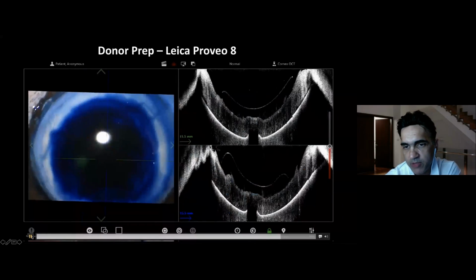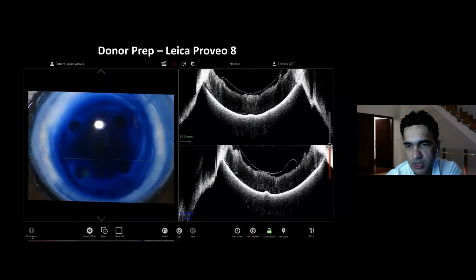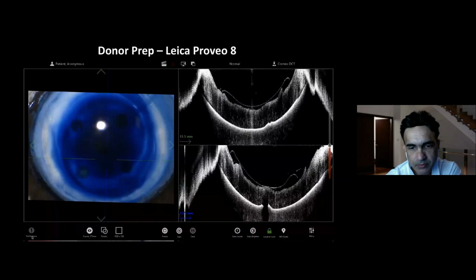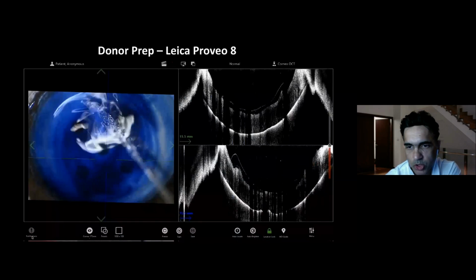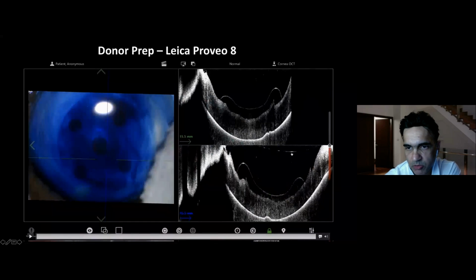Okay, typically we will leave this for incubation for about a minute, and then I'll wash off the fluid from the surface. Okay, so here we go. We're washing off the fluid. So you can see there's a rise in the amount of fluid over here. So now this is the minuscule rise of level of the fluid over here on the top.